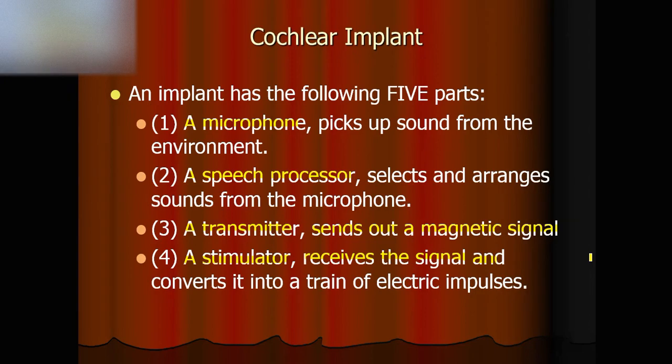So let's remember this. What's the final format of a cochlear implant? Yes. The format is a train of electric impulses. That means the cochlear implant sends out electric impulses inside our brain.